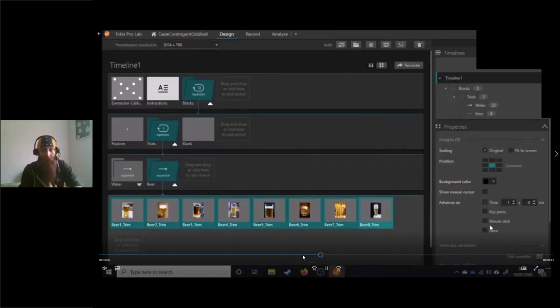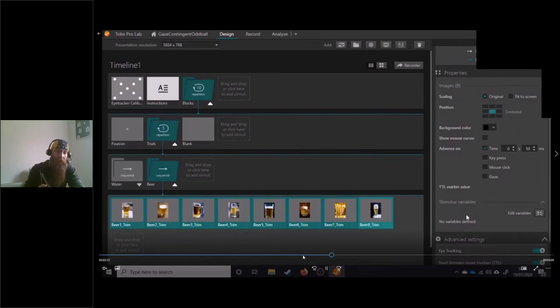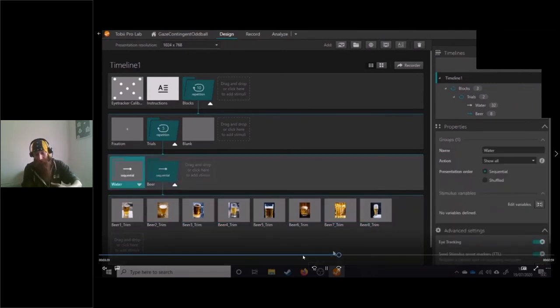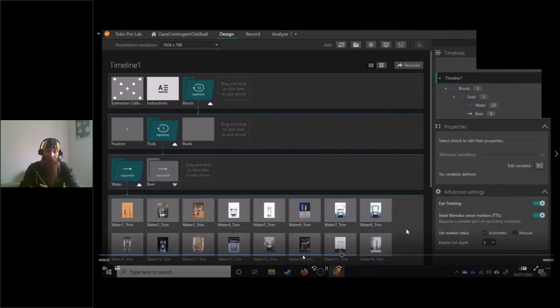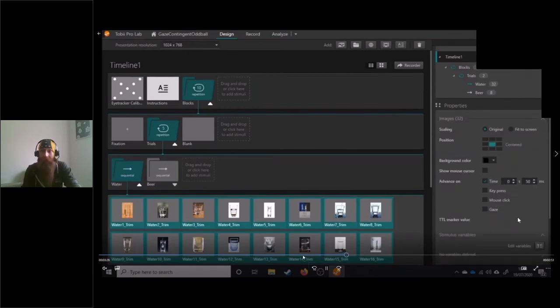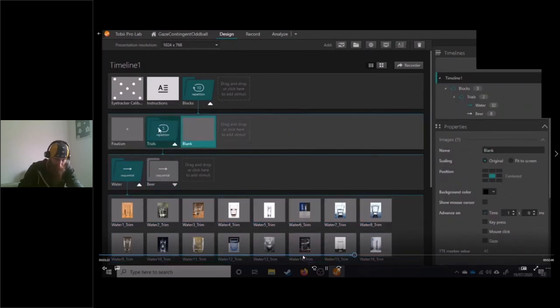For those who don't know, the oddball paradigm essentially involves presenting images in sequence, and you have an odd image, something that is categorized differently in some way, presented at a regular interval. This allows you to either look for P300 waves in ERPs that occur after the presentation of the novelty stimulus, or you can also look for responses at the frequency of the presentation of the oddball. So it's a fairly traditional EEG task.